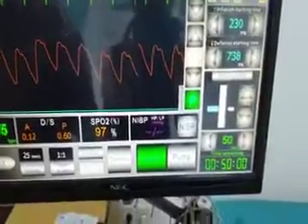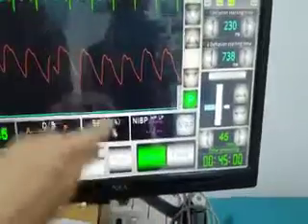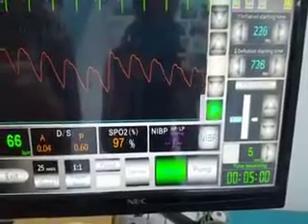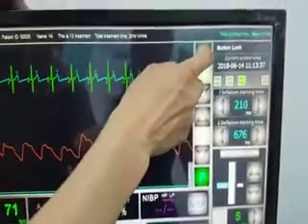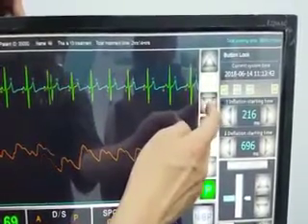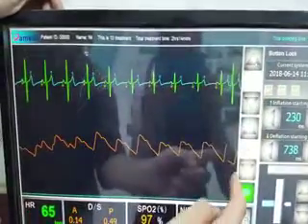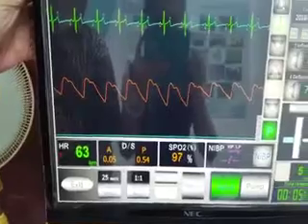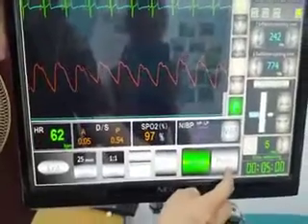Now set up the treatment time. The minimum treatment time is five minutes and cannot be decreased further. You can use the up arrow and down arrow to increase or decrease the size of the waveform display. The oxygen saturation value is now displayed on the monitor.